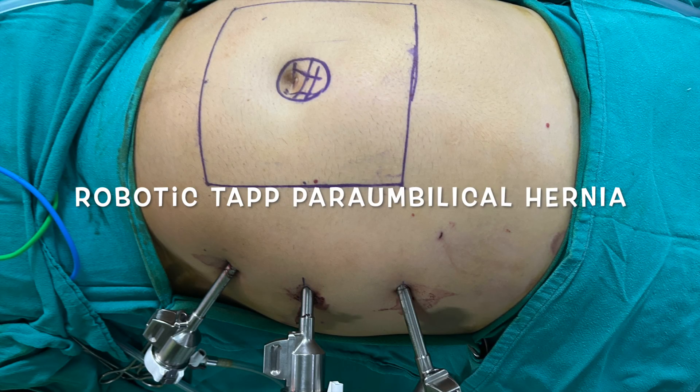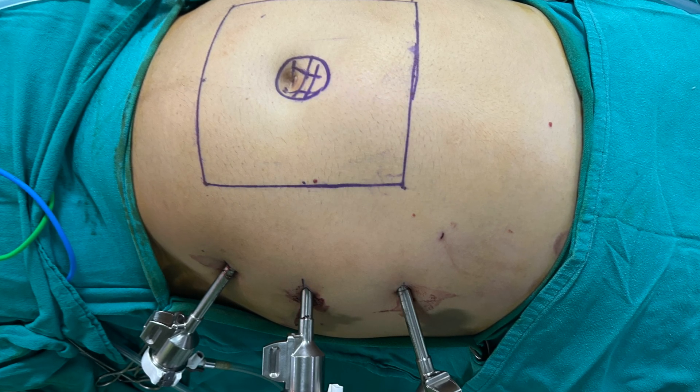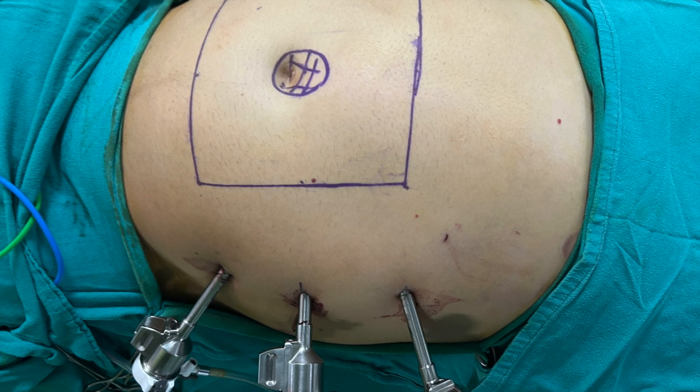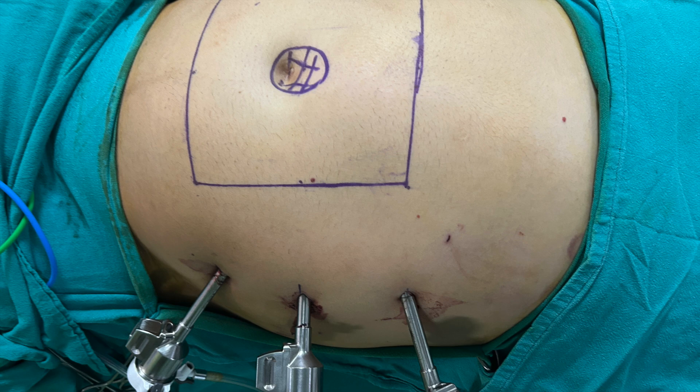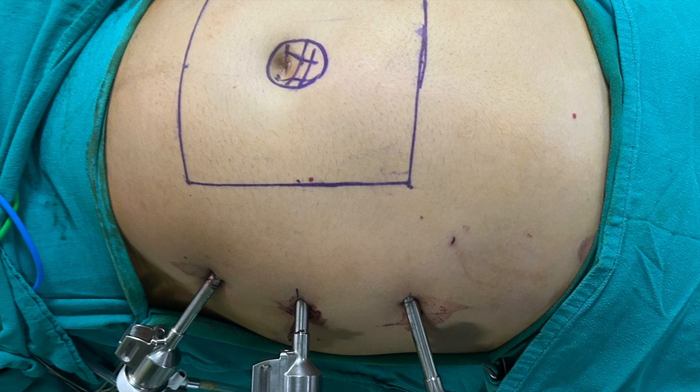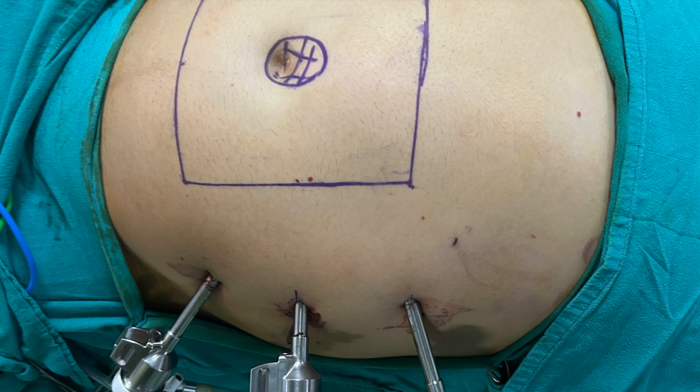Hello friends, this is a video of robotic TAPP for paraumbilical hernia. We insufflate the abdomen from Palmer's point using Veress, mark 7.5 centimeters all around the hernial defect, and place ports as laterally as possible, usually around the anterior axillary line.